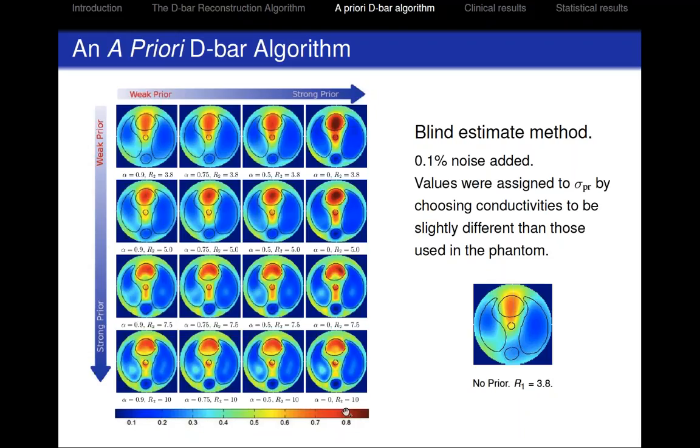You can see features like the spine that were pretty blurred out in the original image show up quite clearly in the version that uses the prior. The lung boundaries sharpen up and the presence of the aorta sharpens up. Of course, it's what you'd expect. If you add information that's known, the conductivity distribution should improve. Things get more interesting on, for example, experimental data where you have priors where you don't assume that there's a pathology, like I showed you with the copper pipe in the tank.